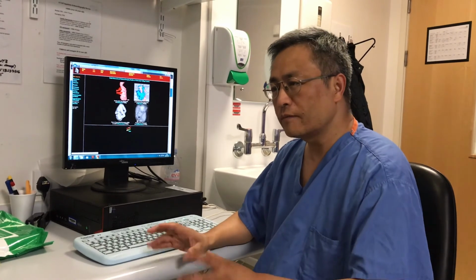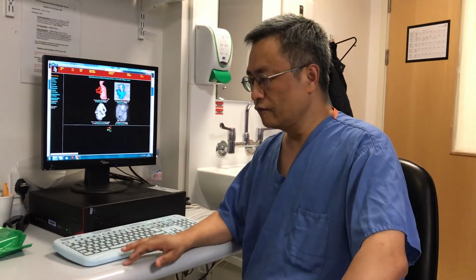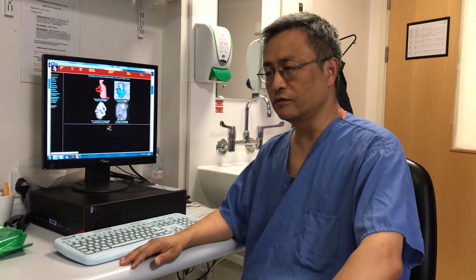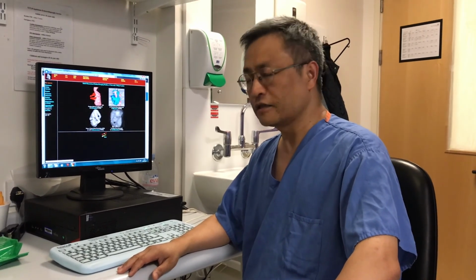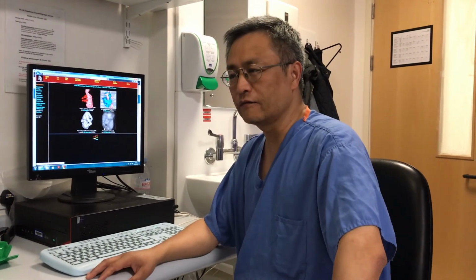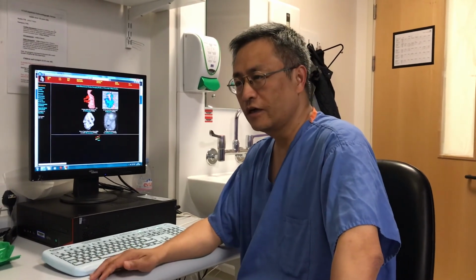If you have a very complex heart malformation, like transposition of the great arteries, the advent of 4D ultrasound has helped clinicians to detect those complex malformations with certainty. 4D has no real meaning for visualizing some simple cardiac malformations like ventricular septal defect or atrial septal defect.